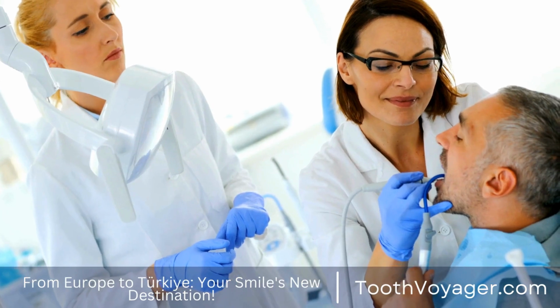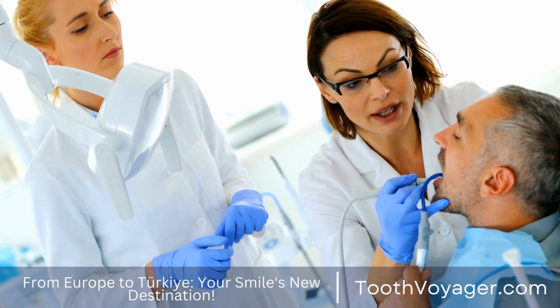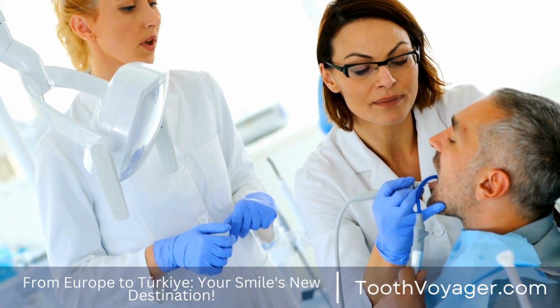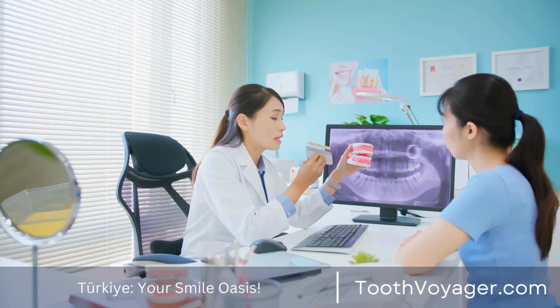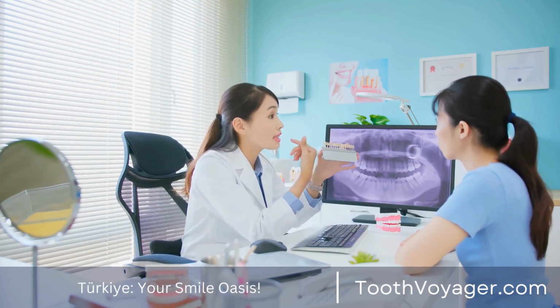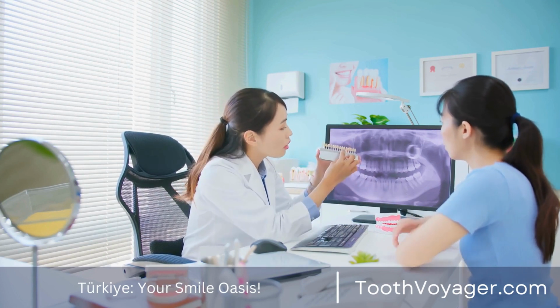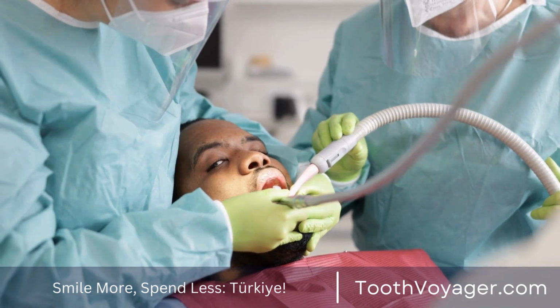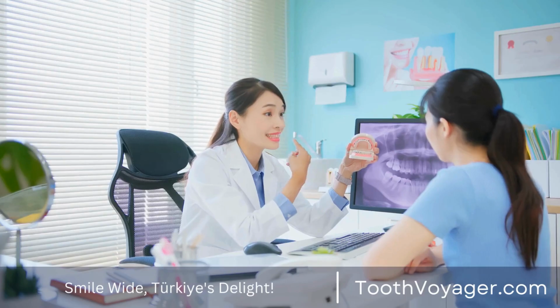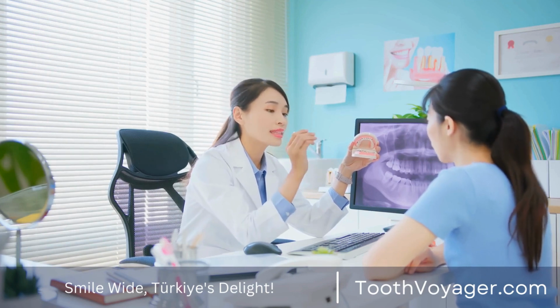Dental crowns, often referred to as dental caps, are prosthetics utilized to replace teeth that are damaged or degraded. The crowns are made to be custom fit on top of the tooth in order to restore its form, size, strength, as well as appearance. The use of dental crowns is common to treat dental issues for a myriad of reasons. In this clip, we'll examine what dental crowns actually are and how they're utilized.